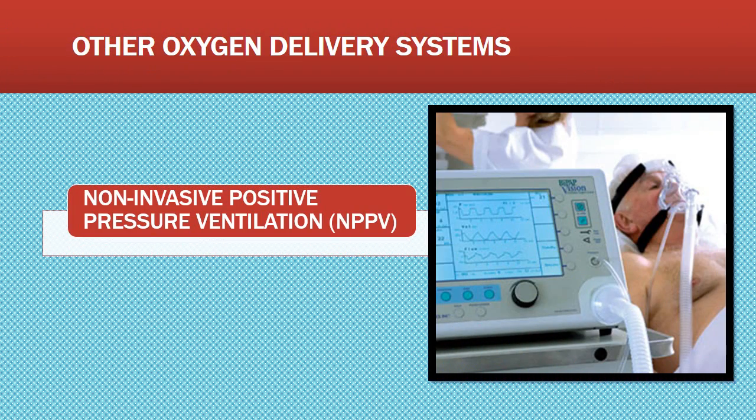Other non-invasive positive pressure ventilation measures would include any techniques that are being used to keep positive pressure to keep the alveoli open and improve gas exchange without the need of intubating a patient. NPPV can be used with oxygen or just on room air, and it is now being used to manage dyspnea, hypercapnia, acute exacerbations of COPD. We're using it for cardiogenic pulmonary edema, for acute asthma attacks, and examples of that would be CPAP and BiPAP.